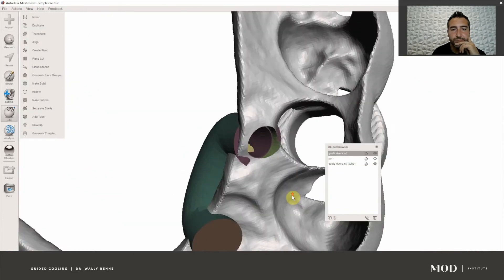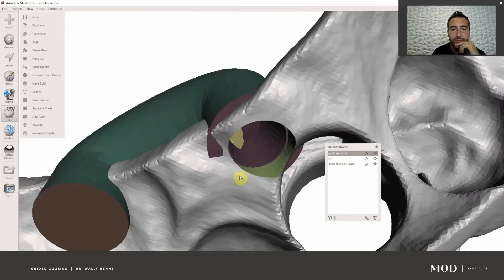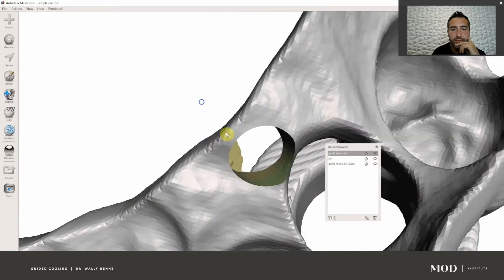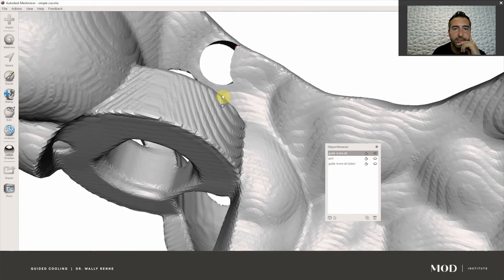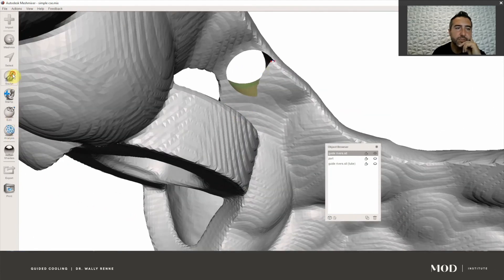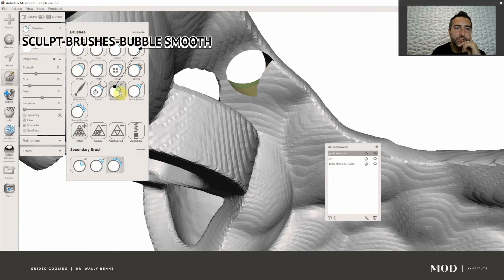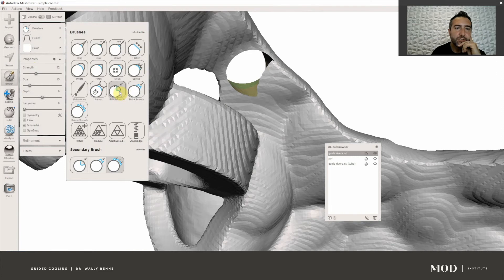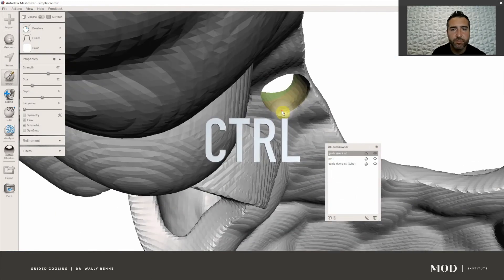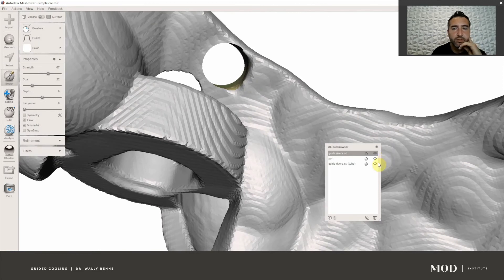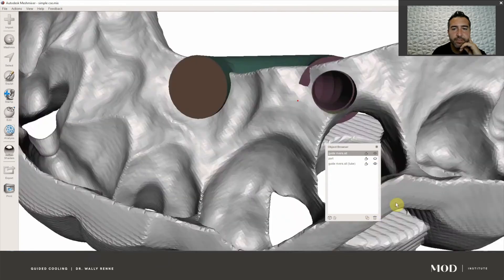We're going to poke a hole and hit Accept. Now I have a hole. There's a little floater right there — I'm going to smooth that back just a little bit. Go to Sculpt Brushes, hold Ctrl, and smooth that little lumen out a little bit.